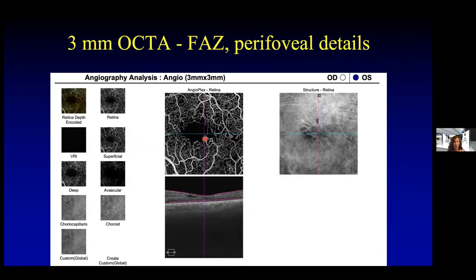What sort of scan protocol do I use when I see my patients? Here's a patient I saw recently in clinic — this is a three millimeter square area scan. We can see that the foveal vascular zone is enlarged with areas of nonperfusion around the fovea. On the en face OCT, we can see some subtle striae and dark spots that correspond to cysts shown on the structural OCT. I like the three millimeter scan to get details about the fovea.